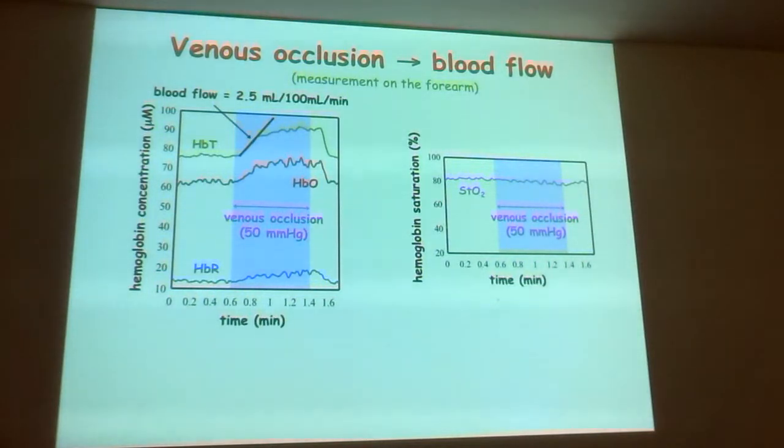And then back to what I just said, I haven't talked about these data in a long time, but I said I think the blood is leaking out. In fact, we know it's leaking out from these data, right? Because if this saturated here because blood stopped flowing into the arm, then what would happen is oxygen would still be consumed from the blood.